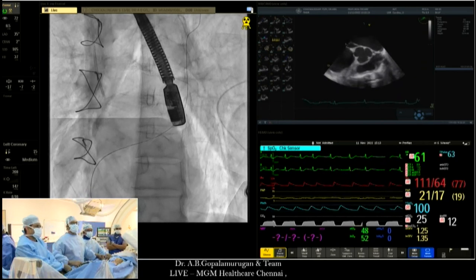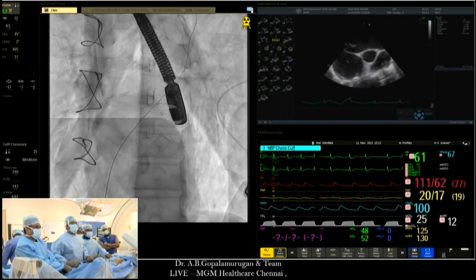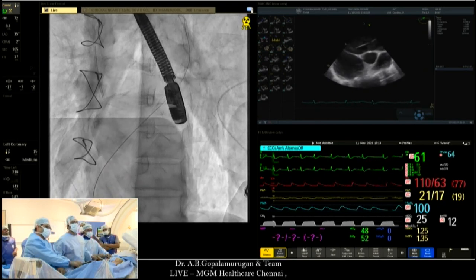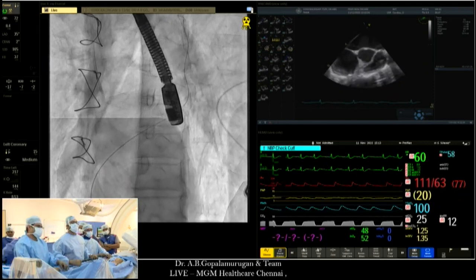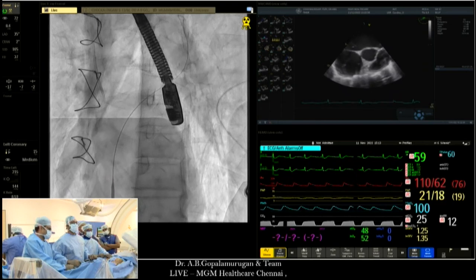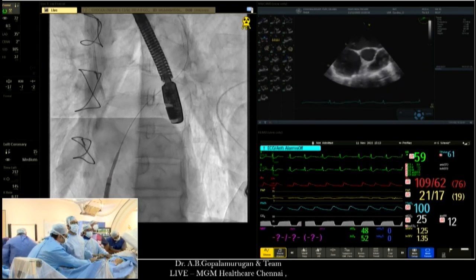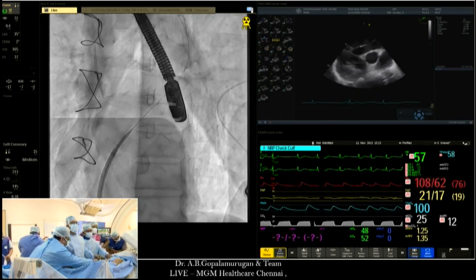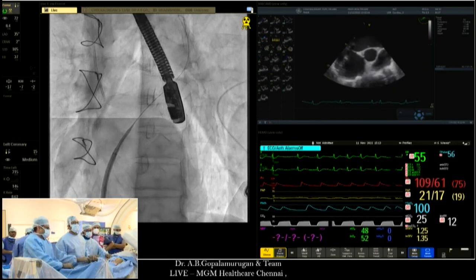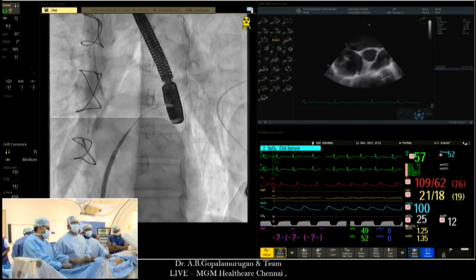So Gopal, how do you take it forward as far as the septal dilatation is concerned? Do you go directly with the 12 millimeters? So I normally use a 14 Mustang. I take a Mustang balloon. I usually find 12 millimeter is all I need to take a Sapien system through. Never had any issues. 12 or 14 millimeter Mustang is my preferred balloon for septal dilatation. And after that, we would take the valve. The valve we are going to take is a 26 Edwards.